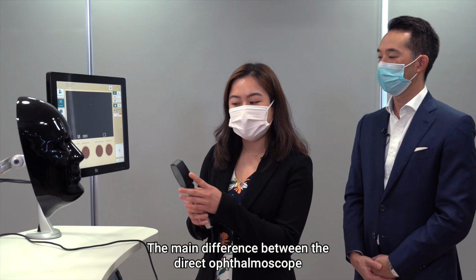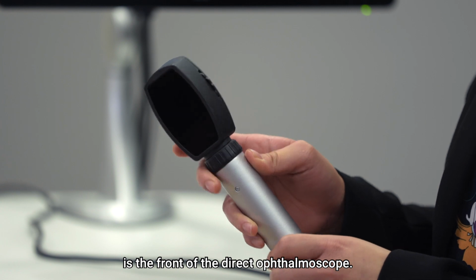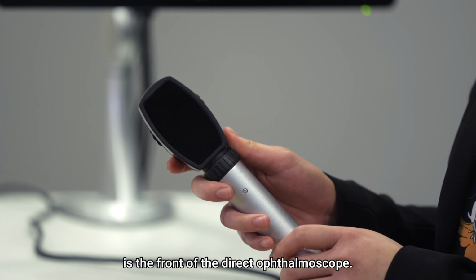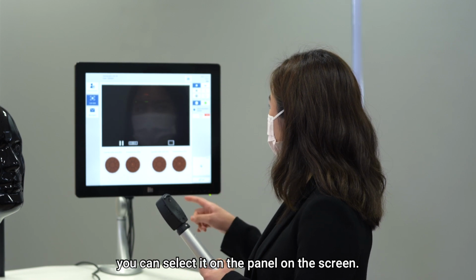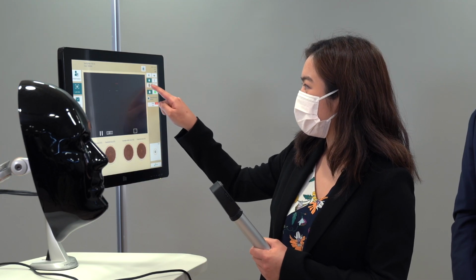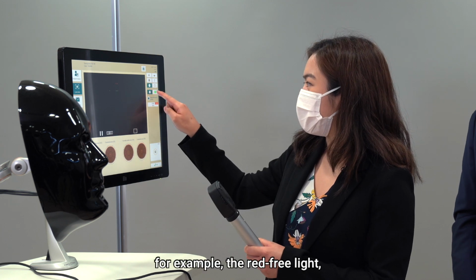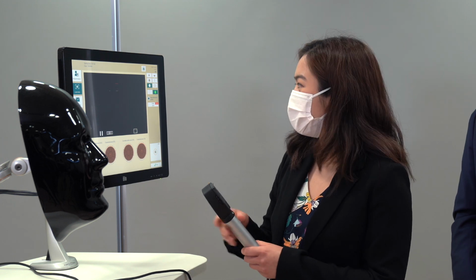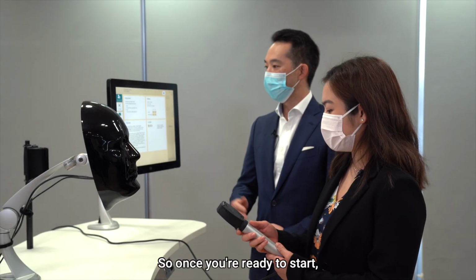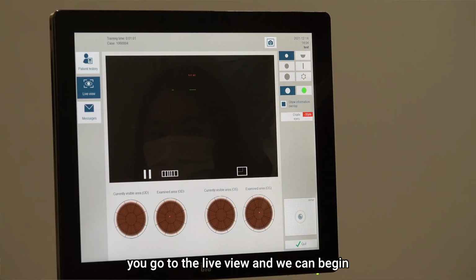The main difference between the digital ophthalmoscope and the real direct ophthalmoscope is the front of the direct ophthalmoscope. To adjust aperture size, it can be selected on the panel on the screen. There are also light filters, for example, the red-free light, which is better for visualizing blood vessels on the retina. So once you're ready to start, you go to the live view and we can begin.